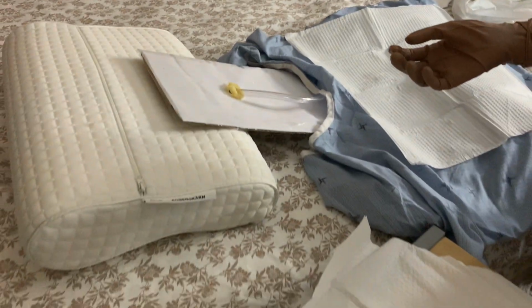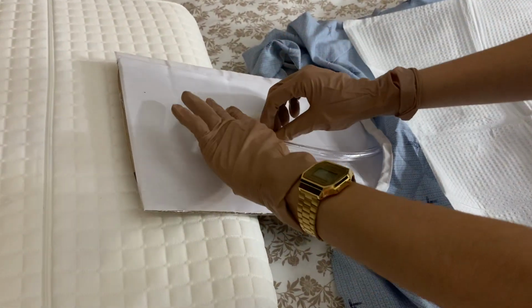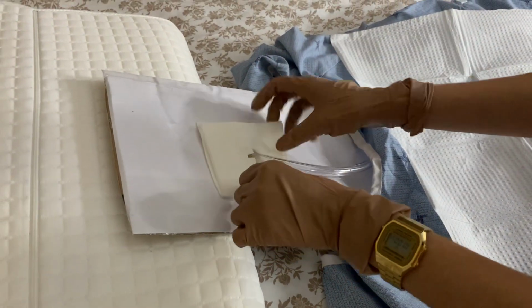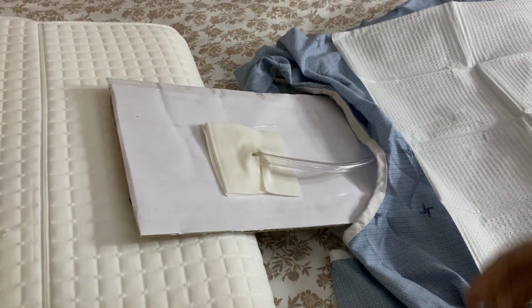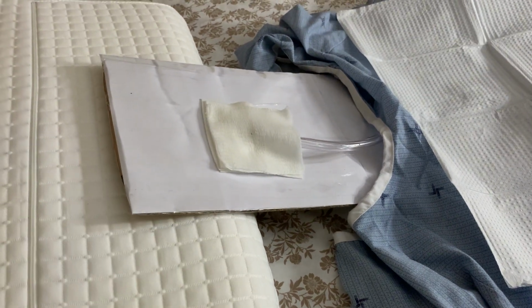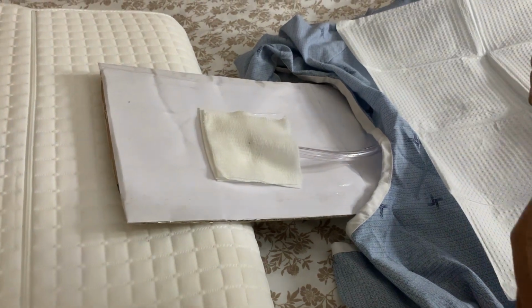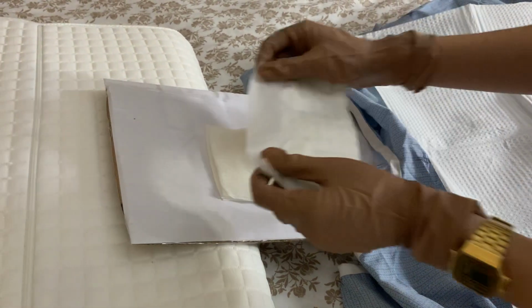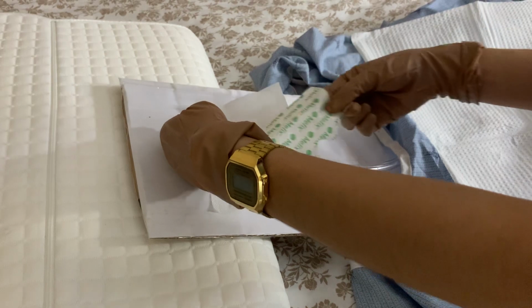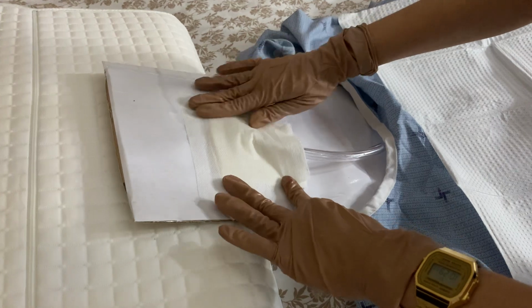Now I'm going to grab my drain sponges, making sure that it's in two different directions. Okay, and now I'm also going to put my 4x4 in. There you go. I'm also going to put on Mefix now, which I've already cut beforehand. And I have also put on my initials, the date and the time. And one more.